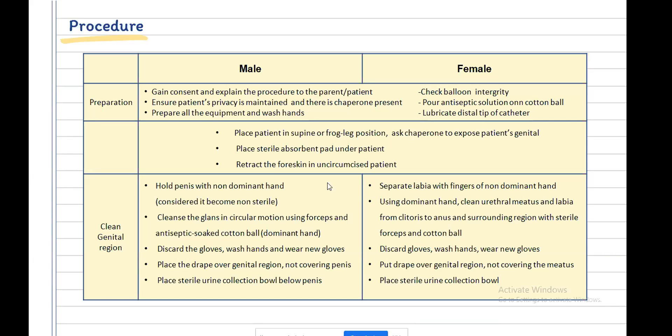Before inserting the catheter, clean the patient's genital region. In males, hold the penis with the non-dominant hand — this hand is now considered non-sterile, so do not touch any sterile equipment with it. Clean the glans in a circular motion using forceps and antiseptic-soaked cotton balls with the dominant hand. Then discard the used glove, wash hands, and wear new gloves.